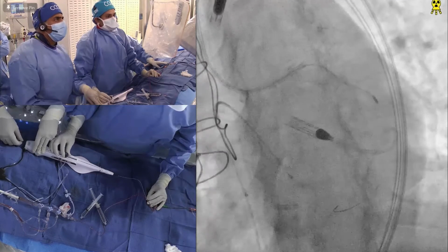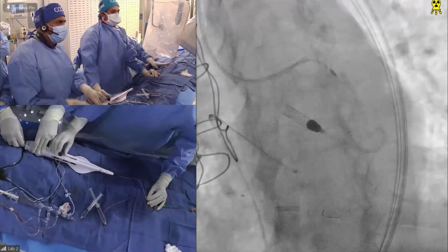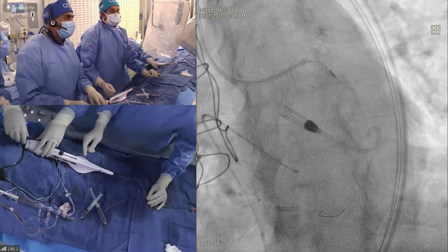I think I don't want to go there. No one. The LV function might have to be increased, right? Proximal a little more, I think, here. I just pulled it.